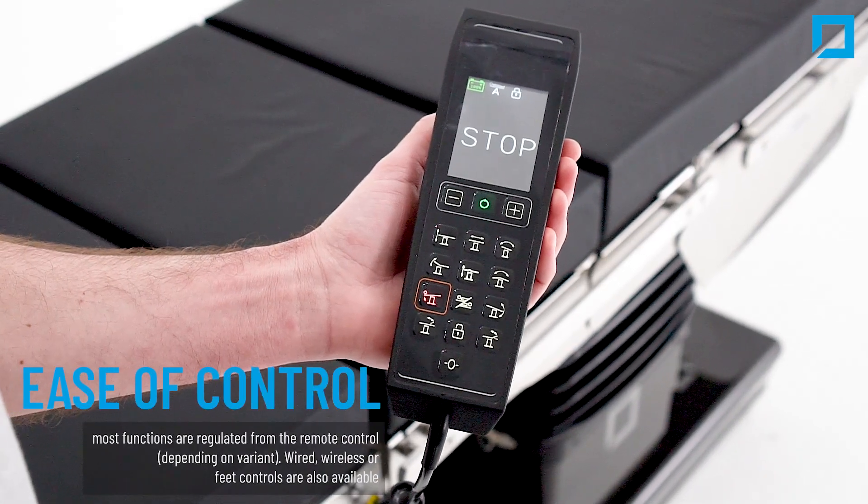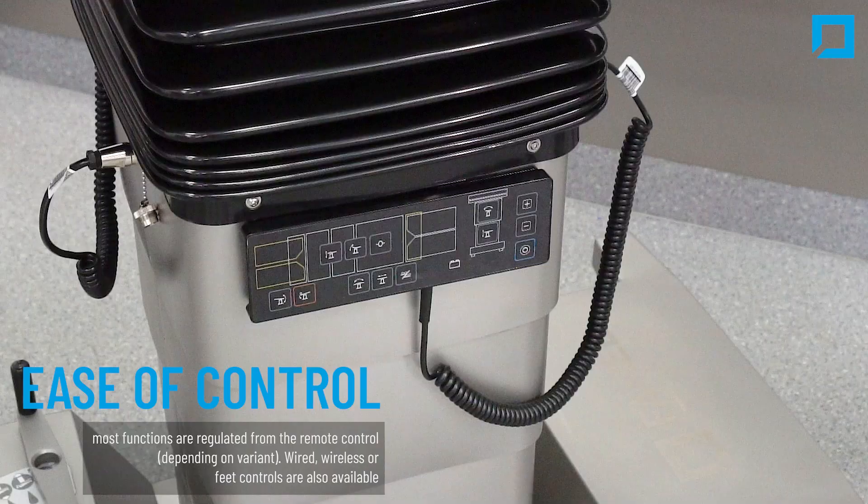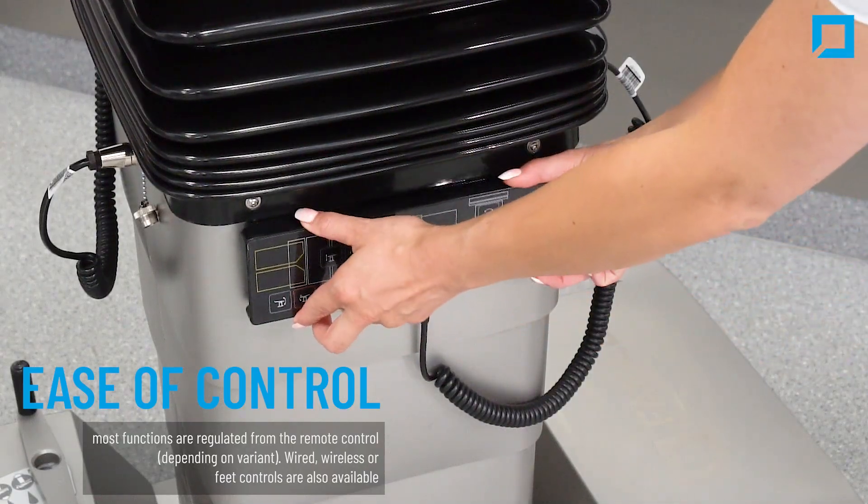Easy to control — most functions are regulated from the remote control. Wired, wireless, or feet controls are also available.